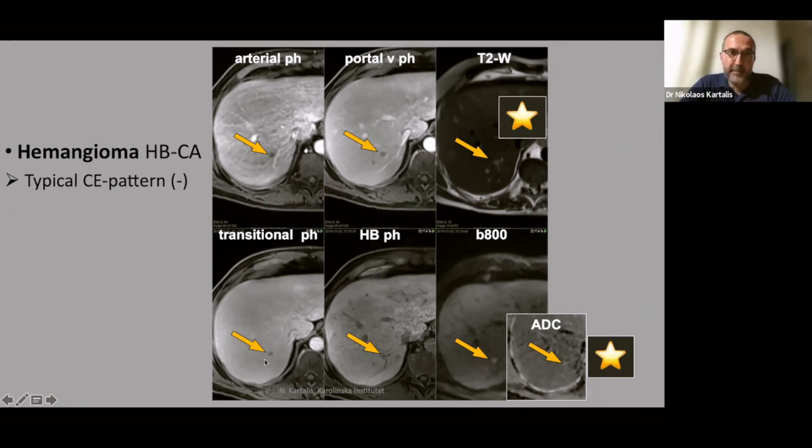If the patient is icteric and does not have a biliary stent, Primovist will not work. If bilirubin is more than, let's say, 3 or 4, the hepatobiliary phase will never come. So it's better to use an extracellular contrast agent, because it's cheaper and you will get the same information.